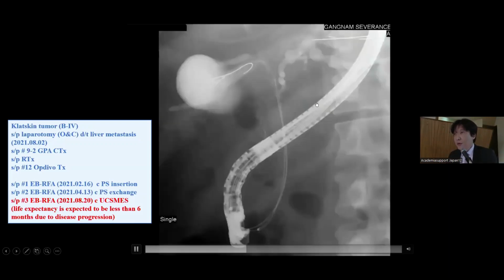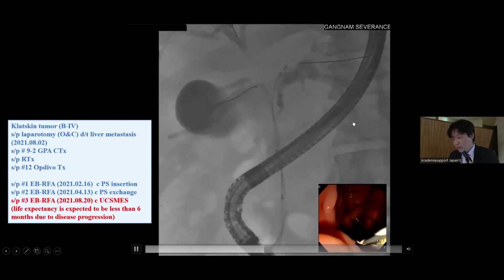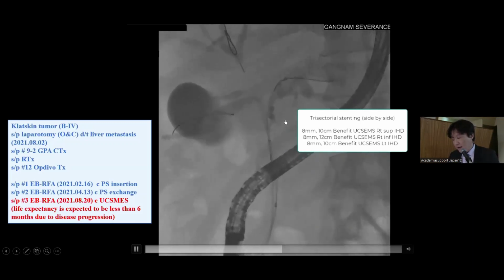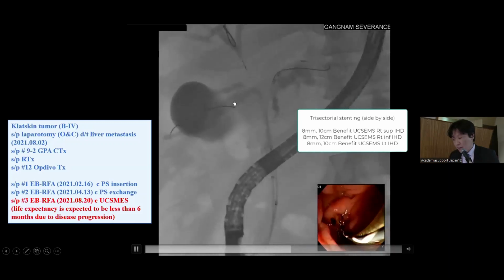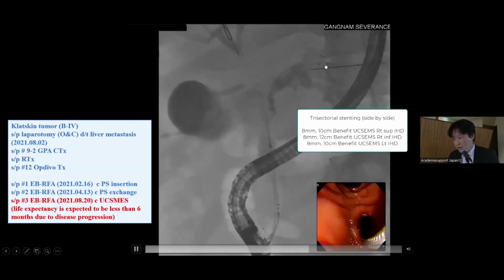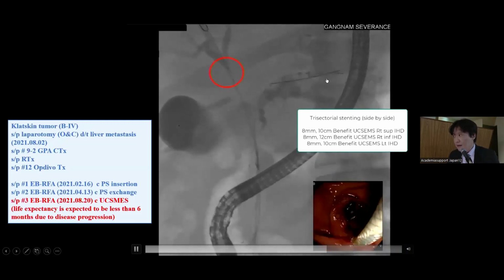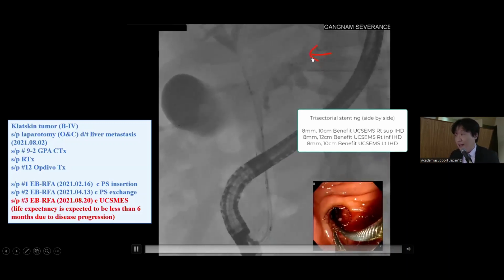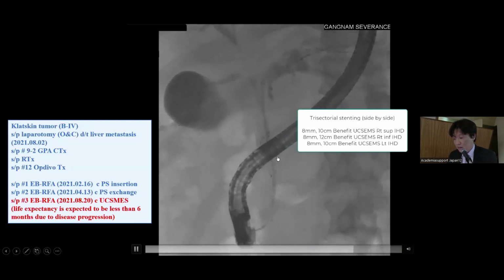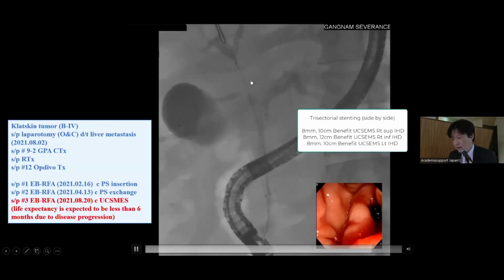After that, we usually perform uncovered side-by-side stent 3-sectorial biliary drainage. Simultaneously, a 6 French, 8 millimeter uncovered stent was introduced on the right and left side. After deployment of the right inferior branch stent across the ampulla, and the left branch, the distal tip of the stent was placed in the common bile duct. Because left IHD stent occlusion can be managed by EUS-HGS, the distal tip was placed in the mid CBD. And lastly, the right superior branch stent deployment was done.